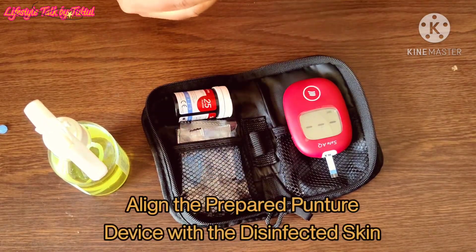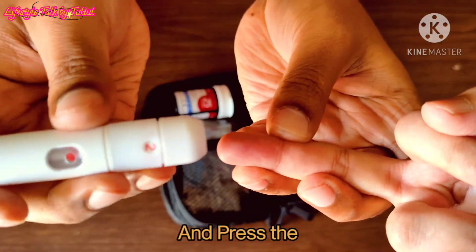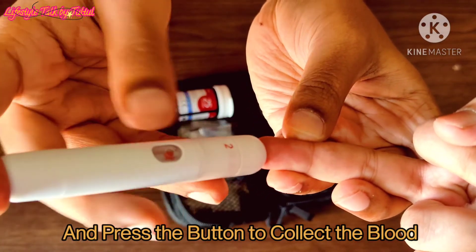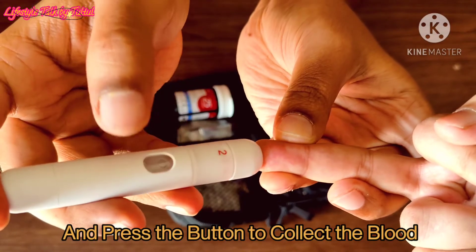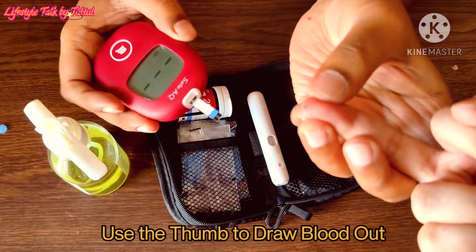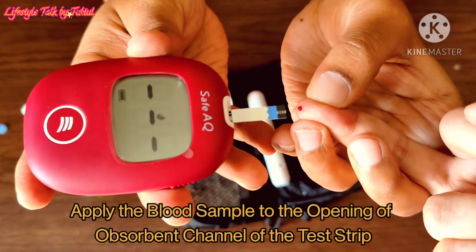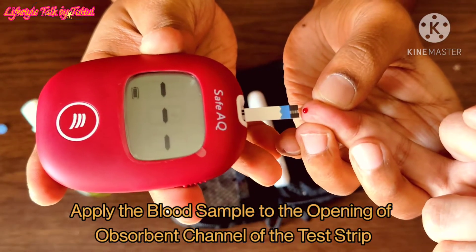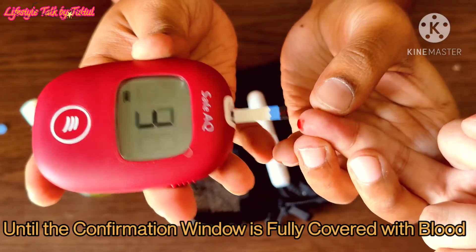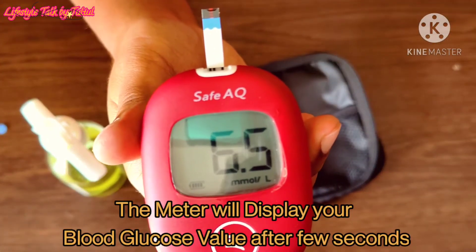Align the prepared lancing device with the disinfected skin and press the button to collect the blood. Use the thumb to draw blood out. Apply the blood sample to the opening of the absorbent channel of the test strip until the confirmation window is fully covered with blood. The meter will display your blood glucose value after a few seconds.